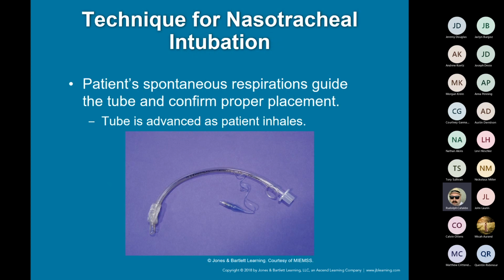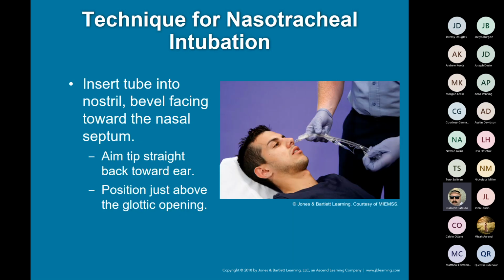Again, it's very similar in equipment. It's the exact same thing, to be honest. You can see here, he doesn't have his preformed. Patient has to be able to inhale. Bevel is always facing the septum, just like we would with a nasopharyngeal or an NPA.